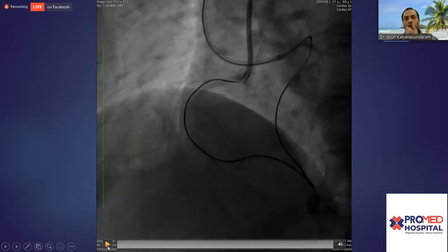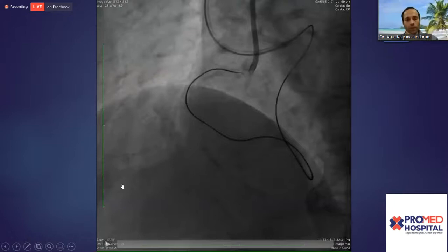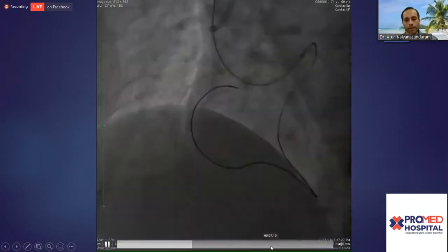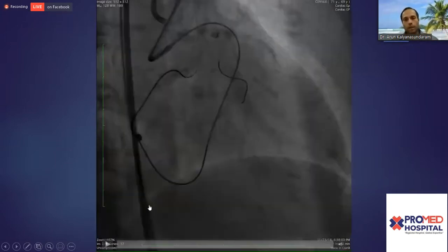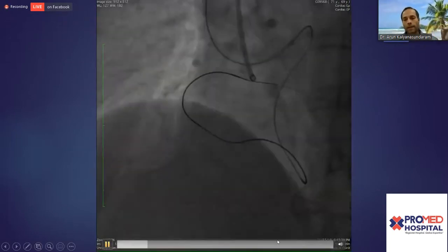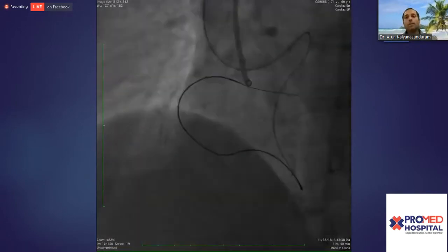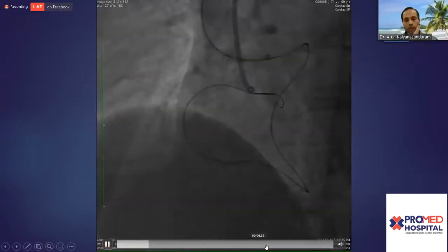I think I needed an Astato 20 or a Conquest 20, as we call it here. Once this was done, I'm going to let this play. So once you've penetrated this, the key, and I see this mistake done, you want to confirm in two positions. One of the key things that I tell people is do not snare a stiff wire. I see this done. It's going to just get you into trouble someday or another. So once it's done, switch, snare the wire that you're going to externalize. Typically, again, an RG3 here.